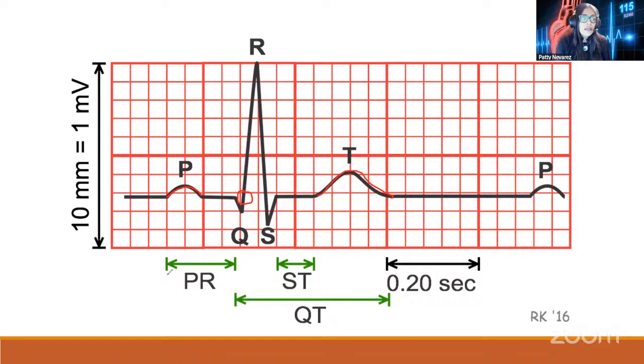It's like if I have a football player in front of me and you are in front of the football player, you won't be able to see me because I'm smaller, I'm shorter. So it is there, the repolarization of the atria does occur somewhere around here, and then is ready for the next beat. And then we have some space before the next beat. So all this together is one beat.